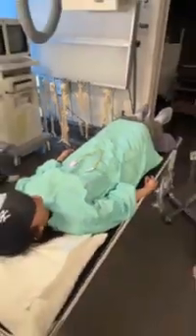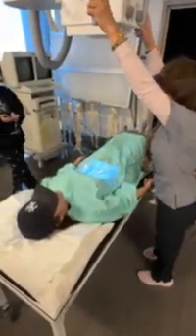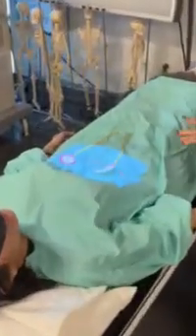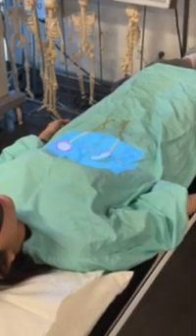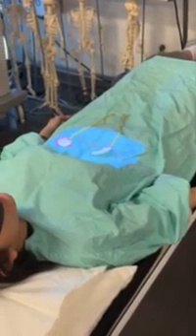So by now, the first thing I'm going to do, since I was already set up to do a cone down, right? The first one will be at the 1 minute, and it will be my, whatchamacallit? What's the image that shows the outline of the kidneys barely? The flush. So the flush.